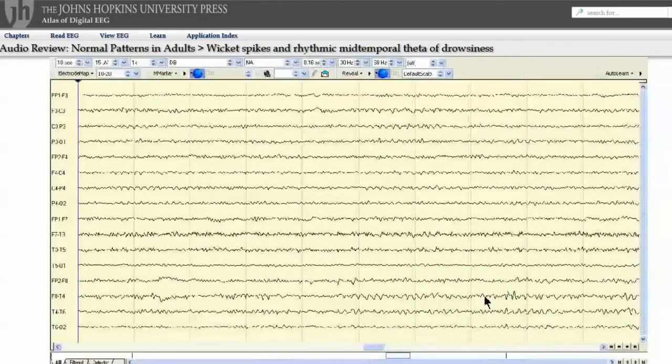In summary, one of the major determinants of benign rhythms is the notched shape of the theta or alpha frequencies. They will wax and wane, and even though there is a field, and occasionally they may potentiate, the presence of higher and lower frequencies encountering each other is a hallmark of a benign rhythm.